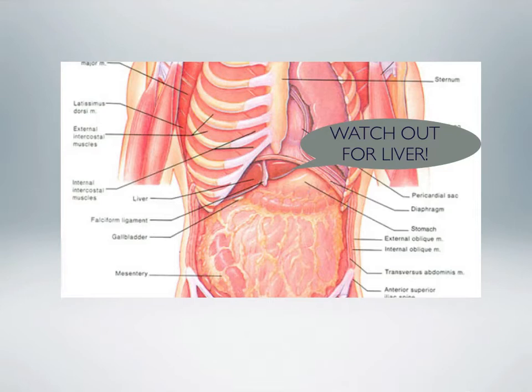For me, I prefer to go parasternal in one particular circumstance, and that's where there is no backup, or perhaps another circumstance where I'm worried about bleeding. Backup is typically available in U.S. hospitals. We're not in Tamale, Africa.